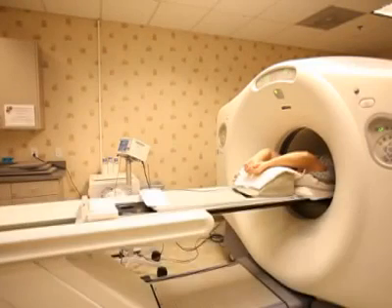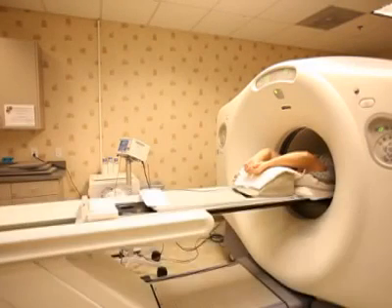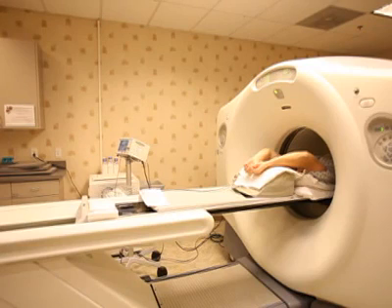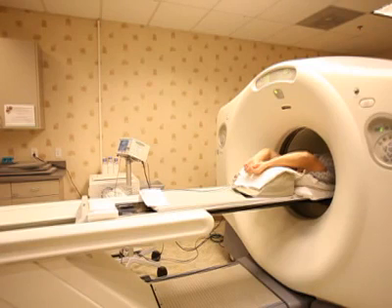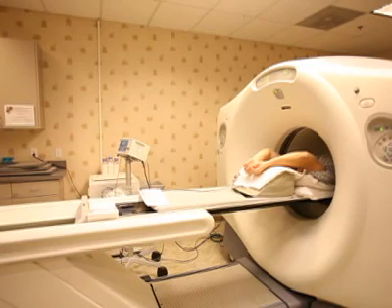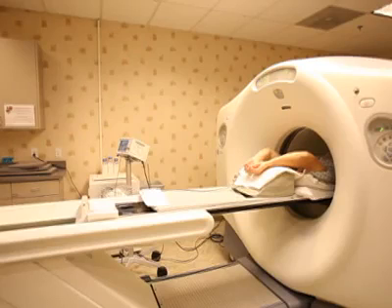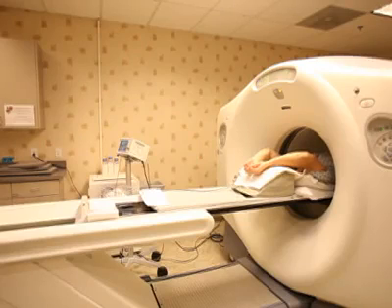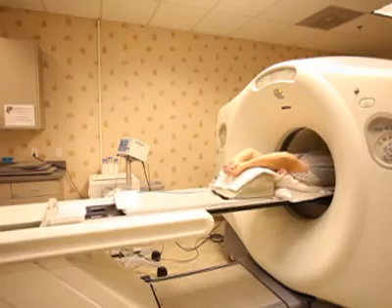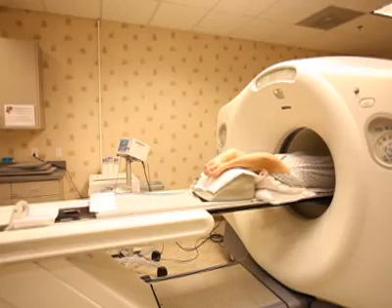Take a deep breath in, let it out, take another deep breath, let it out, now take a deep breath and hold it — breathe.